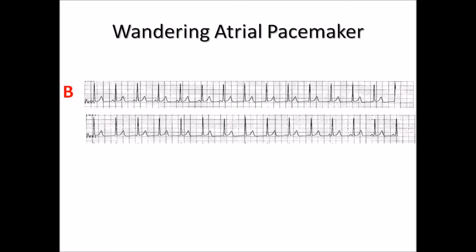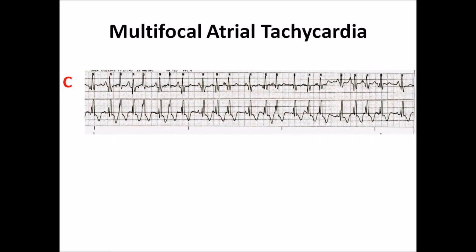Strip B is wandering atrial pacemaker, or WAP. These kinds of rhythms are difficult to catch in short strips. However, cardiac telemetry makes it easy, but you need to inspect and follow the P-wave transition. Strip C is multifocal atrial tachycardia. Notice the variable P-wave morphology. This rhythm is often misread as atrial fibrillation, so be careful next time you encounter this rhythm.